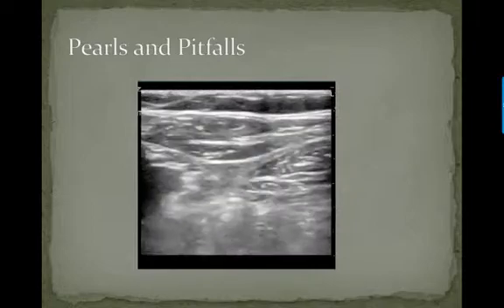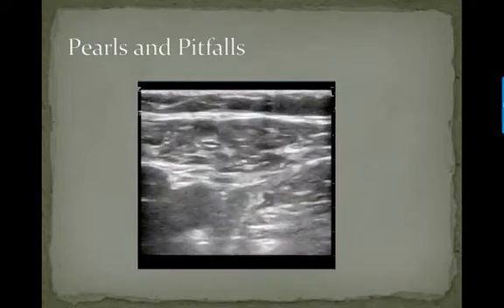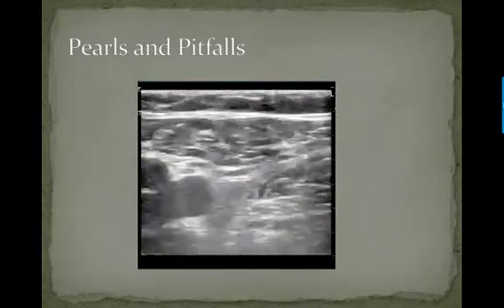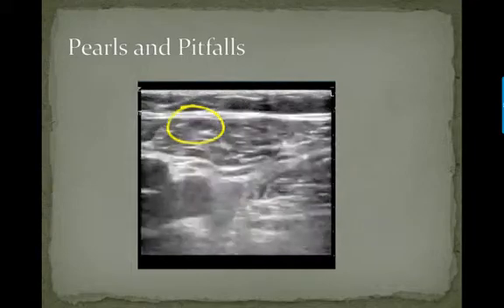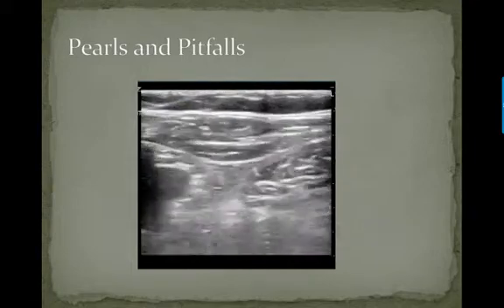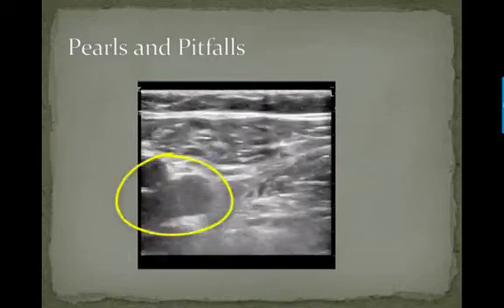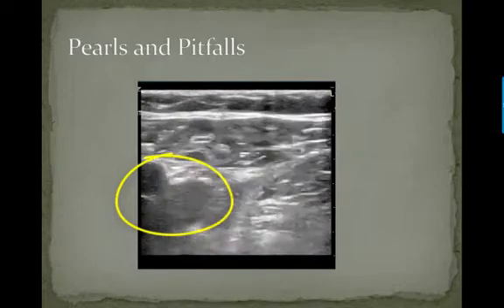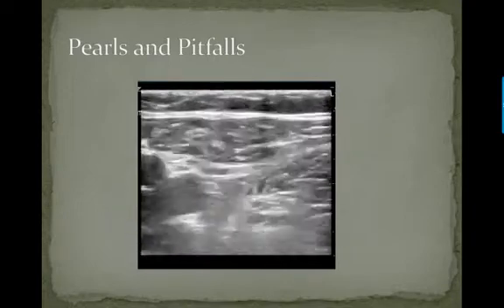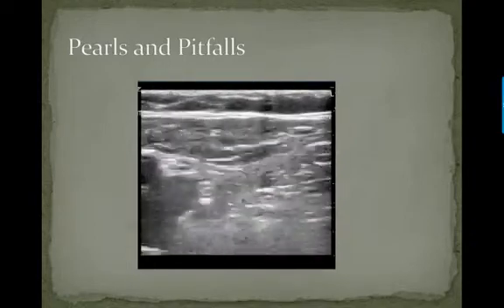Another pitfall — looking at this study, you can see they are looking at the wrong vessel. They are focused on a superficial vein which is completely compressing, and most likely calling this study negative. However, they should be focused a little lower, where you can see the femoral artery and vein — the larger, deeper vessels which we're looking at for the study.